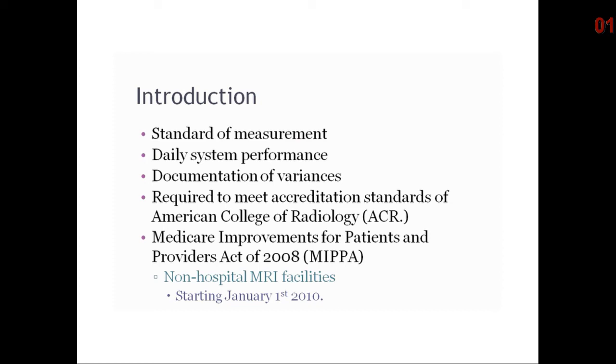In an effort to increase the level of image quality across the country, the ACR developed the Medicare Improvements for Patients and Providers Act of 2008, which mandates that any non-hospital institution performing advanced diagnostic services like MRI must be accredited by January 1st of 2010 in order to receive Medicare reimbursement.